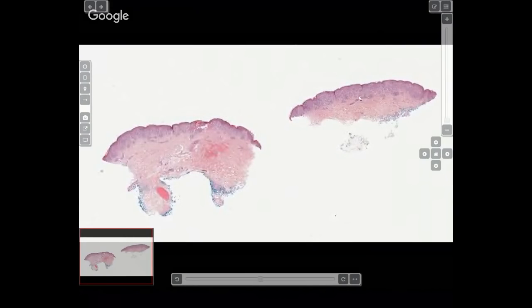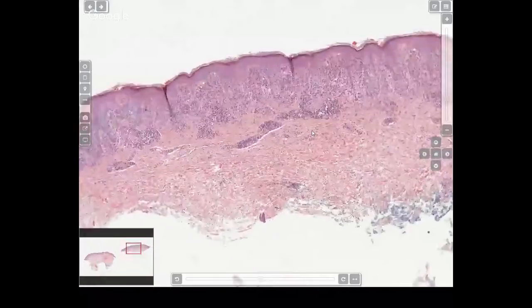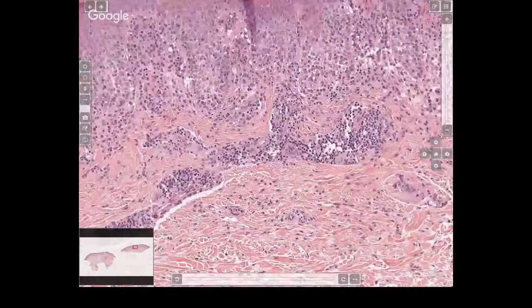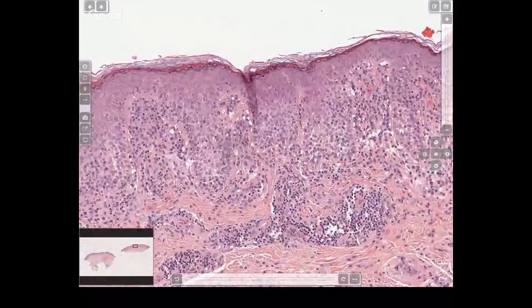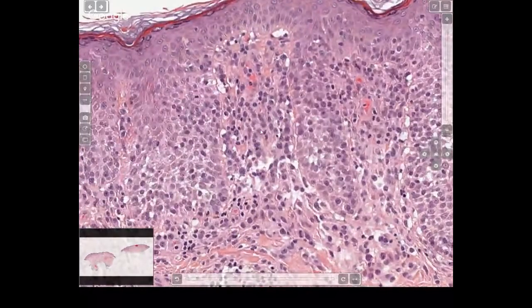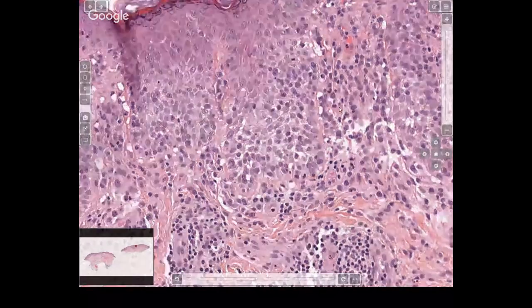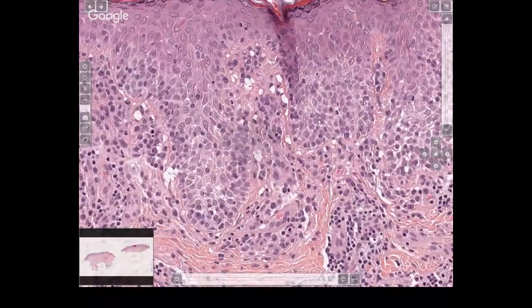Histologically, again, you see a lichenoid infiltrate. But what is different about this lichenoid infiltrate? There's a lot of lymphocytic exocytosis. So you see a lot of lymphocytes going into the epidermis. You have the infiltrate, but now you have these large lymphocytes with some atypia, even some cerebral convolution that you are seeing in the epidermis. So a large number of lymphocytes going into the epidermis.